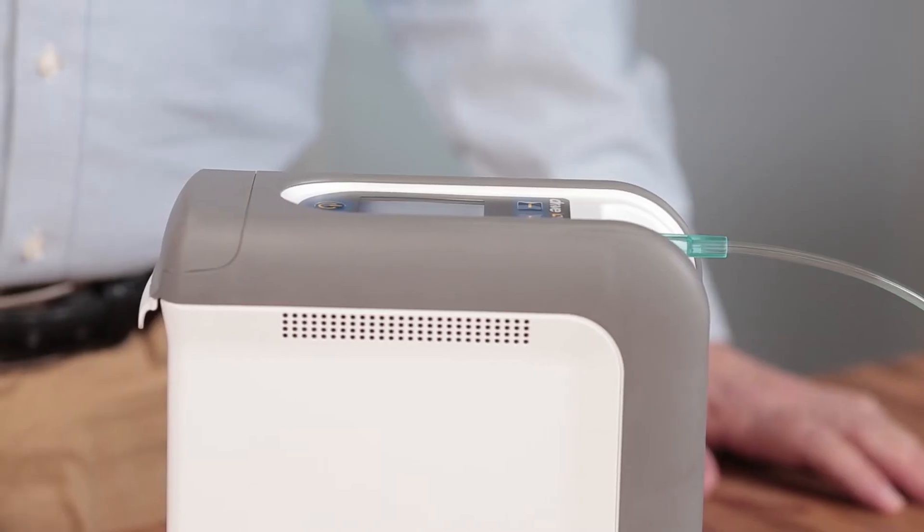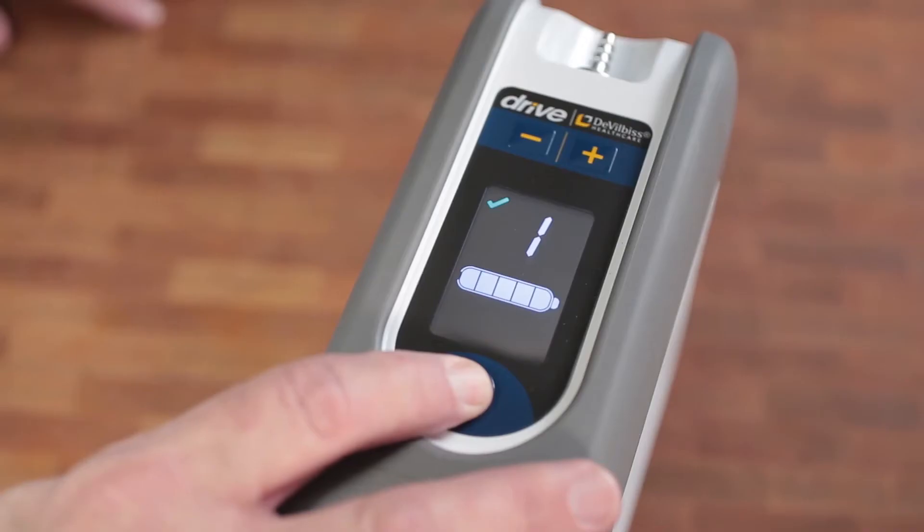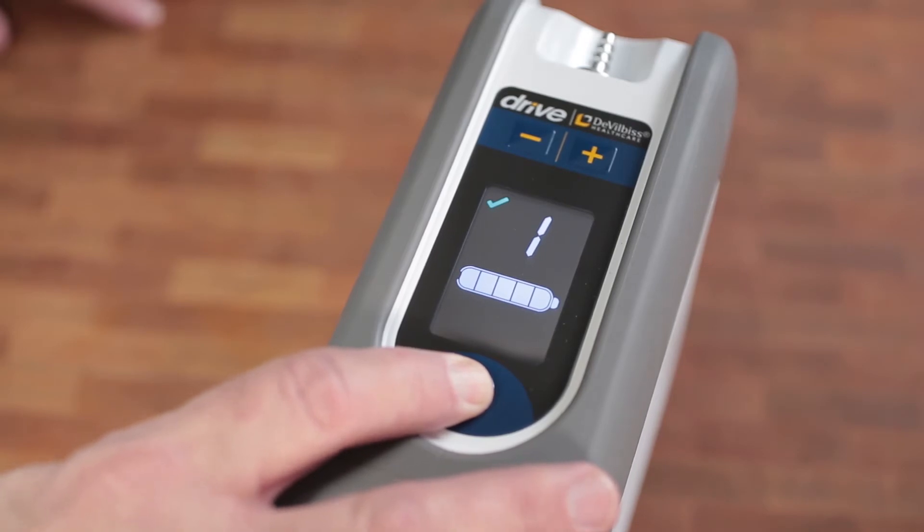When the device is turned off, the setting will remain at the same oxygen setting when your iGO2 is turned back on.